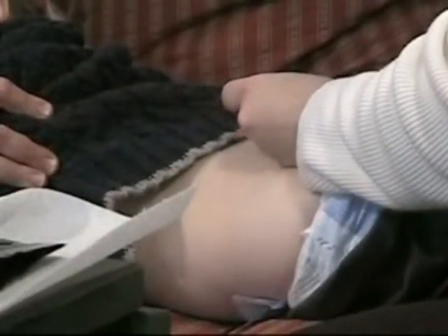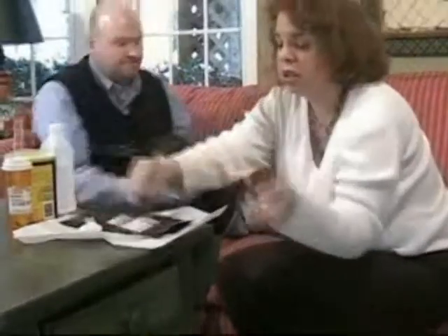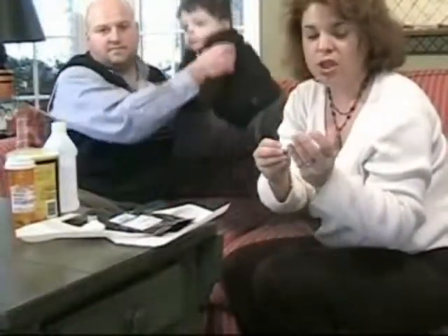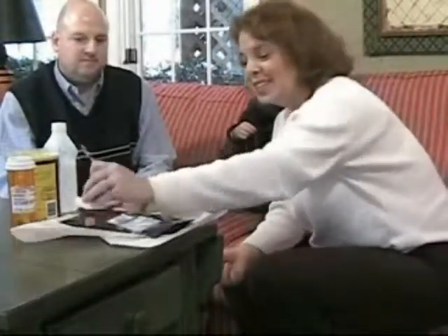Pull the Band-Aid off to where I see the cream is. I go in on the angle, give him a shot, pull it out. That's it. Clean it off. I clean him off again, just to make sure for myself. That's it. The child did not feel that whatsoever. And that's awake. And that was my first time administering it awake with the phobia of needles.